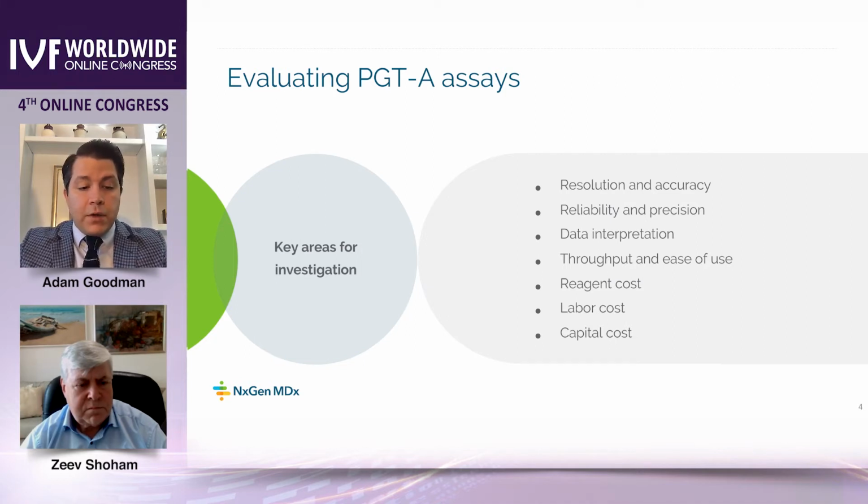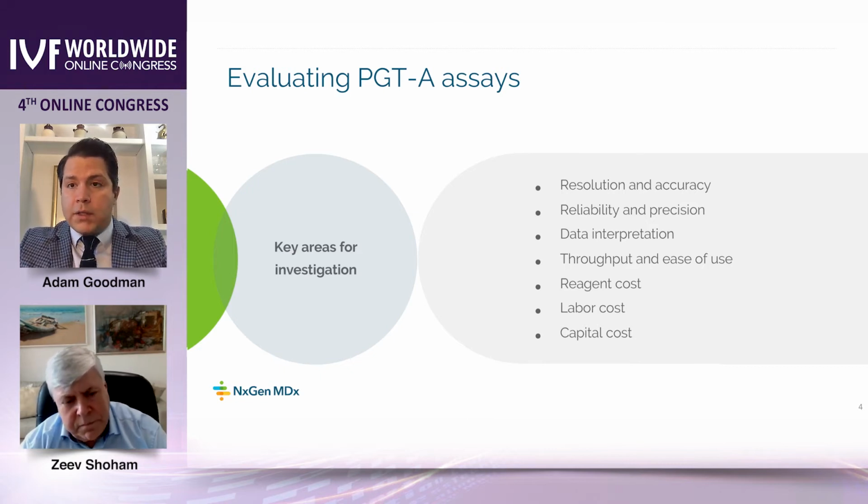And finally, I want to know more about the associated cost than just the per sample price under ideal circumstances. I want to know the per run cost and the run size options available. Very few labs have enough sample volume to fill every run to its maximum, so you need to know what your costs will be for runs performed under 100% capacity.